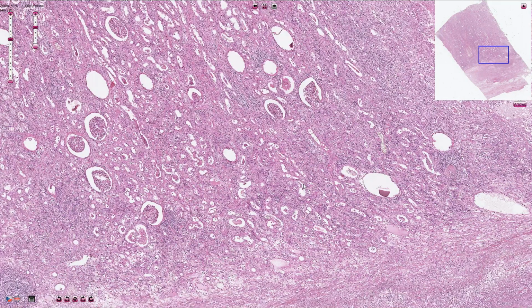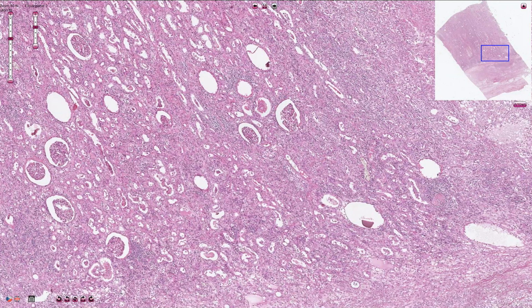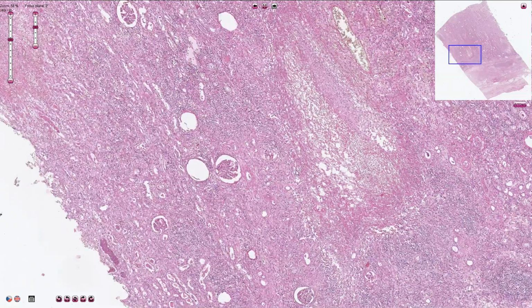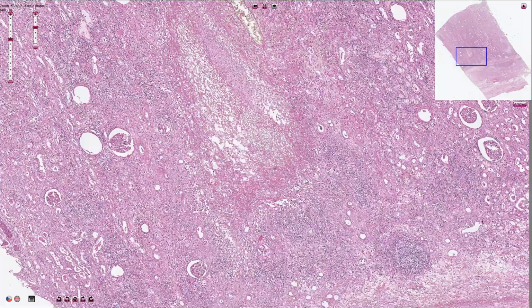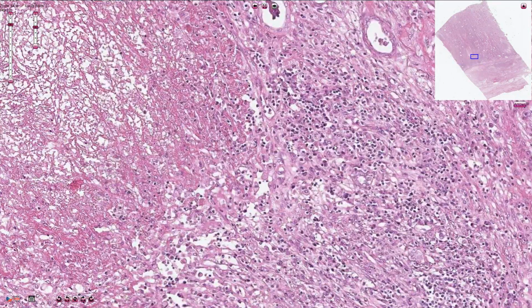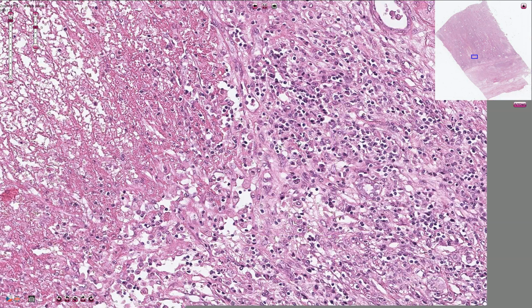Typical for acute pyelonephritis is microscopic neutrophilic infiltrate, which is typically localized in the tubules, and glomeruli are relatively spared, unlike in some cases of glomerulonephritis. Sometimes we can see abscess formation, like here, for example, and if we go closer, we could see that all of these inflammatory cells are neutrophils with irregular lobated nuclei.